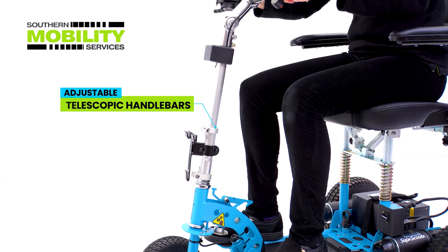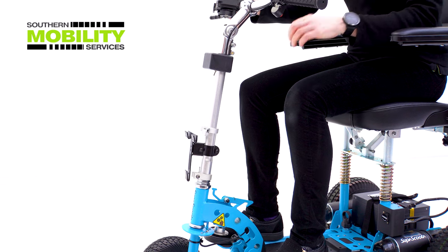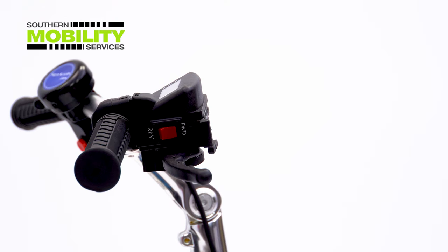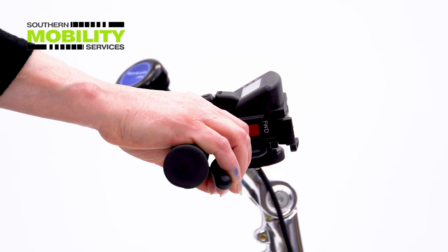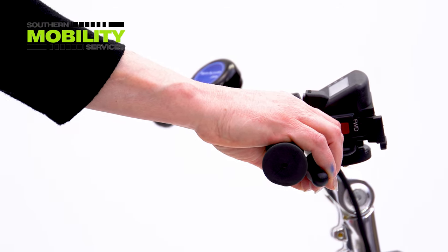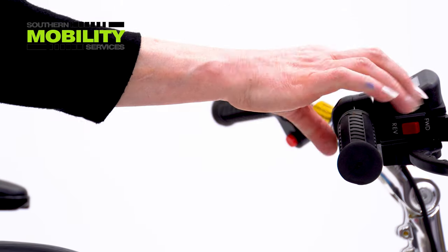With height adjusting handlebars you can achieve maximum comfort for your driving position. Driving the scooter backwards and forwards is a one-touch operation with a handy little switch right next to the accelerator lever.